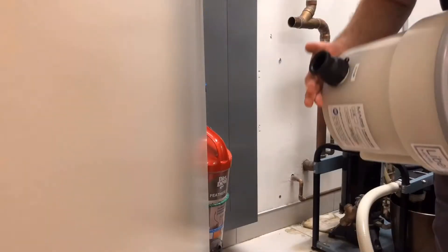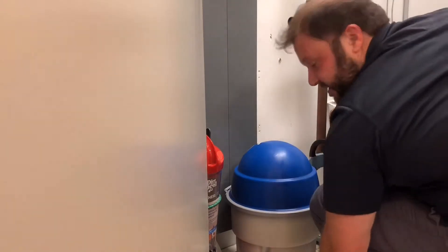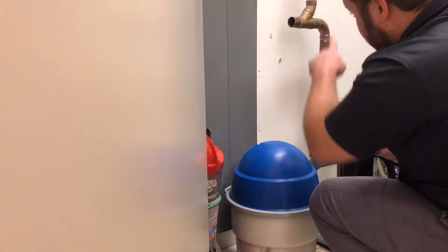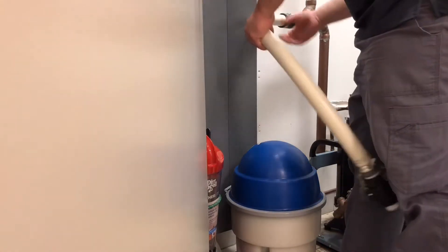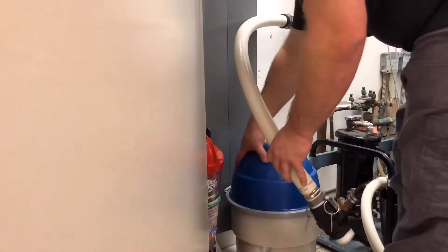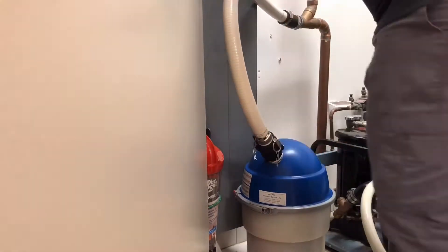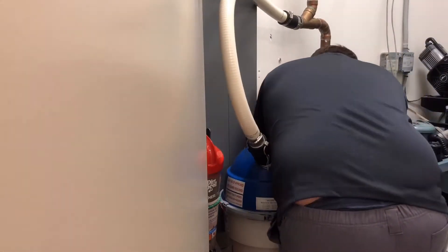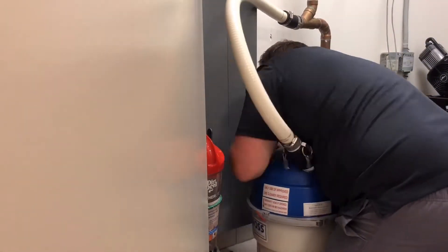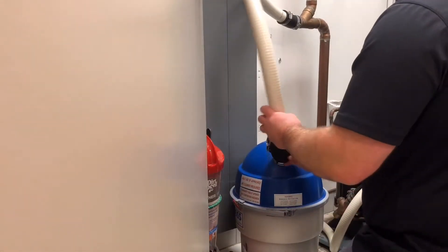Thread the pre-Teflon tape nipple into the outlet of the Liberty Boss, then place it in the location of the mechanical room you feel is best. Choosing the correct location and angle may take some trial and error — at this moment, nothing is permanent. Because the inlet hose length is the most adjustable, it is best to start with the outlet hose, choosing the best location of the Liberty Boss for the outlet hose, then working from there.